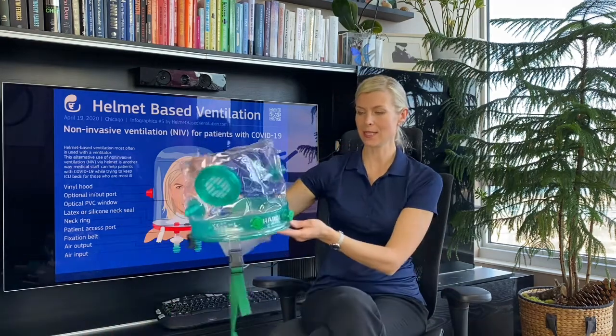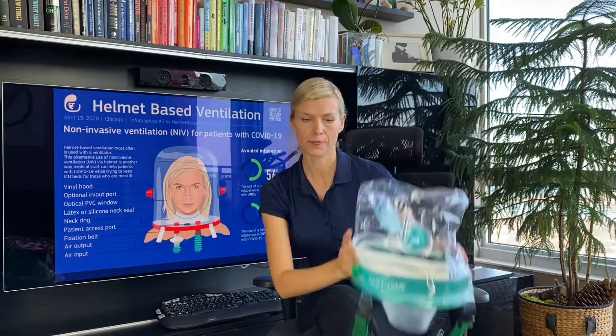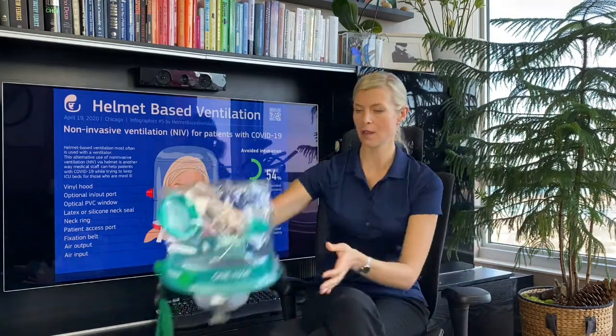Hello, my name is Aurika Savickaita. I'm a co-founder of HelmetBaseVentilation.com. In this video I will show you two helmets made by Italian company Harrell. So let's start with the One Har.